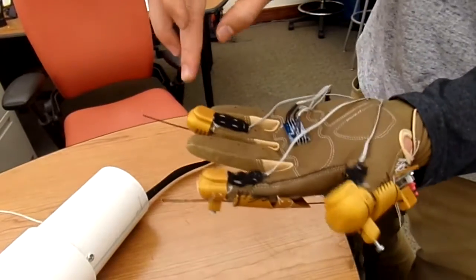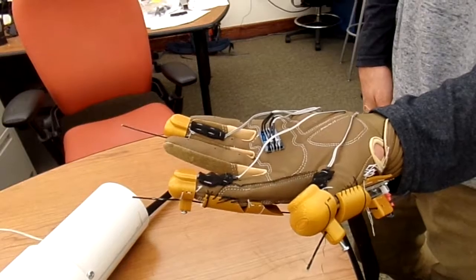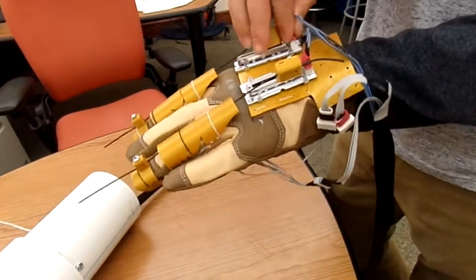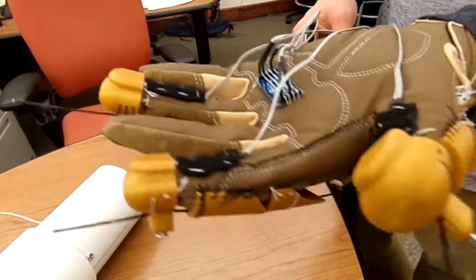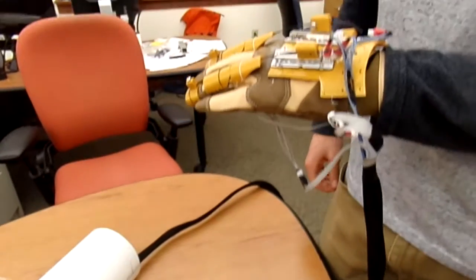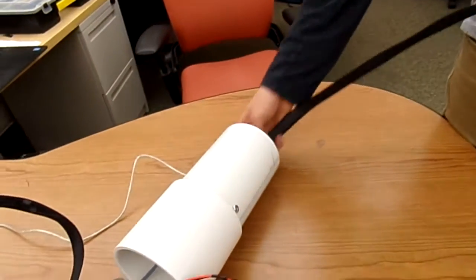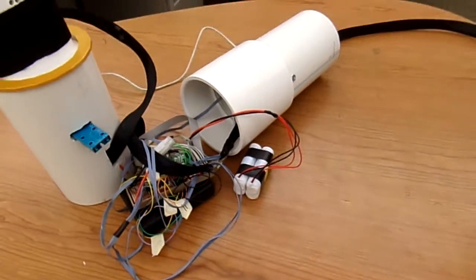We also have a vibrating motor in each of the fingertips, which are used for haptic feedback, and all of these are connected with these little connections so that we can easily remove them and use the hand or move the hand without being connected to the rest of our electronics. All of this was run through this cable housing and into the main body of our prosthetic arm, where we house all of the electronics.